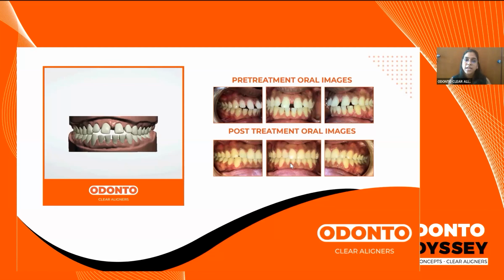But if there are any heavy contacts for the premolar, in that case we will relieve those contacts so that there won't be further wear of the tooth, and we can prevent it from worsening. But corrections, we do not bring about those corrections. I hope that answers your query regarding your premolars.